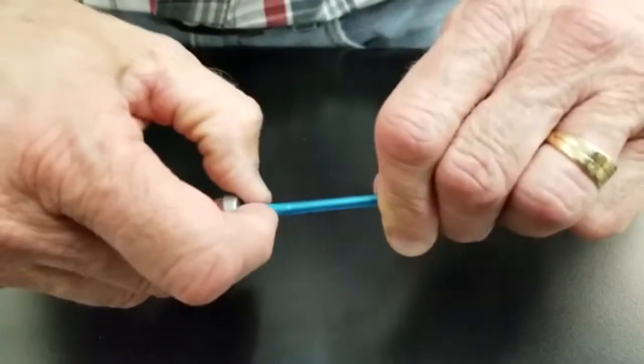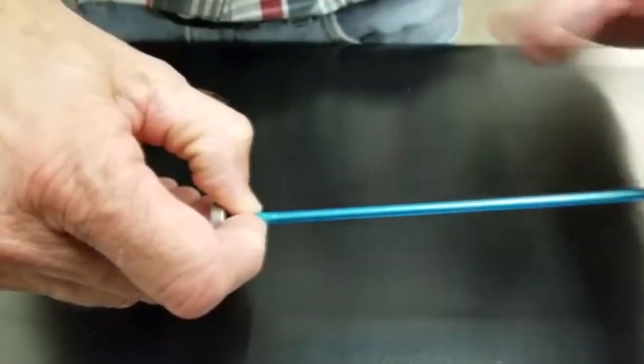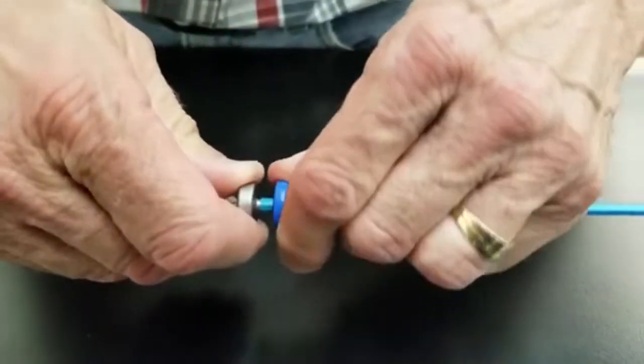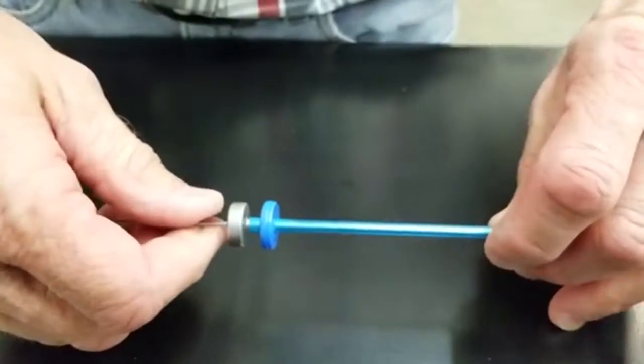Hold it with your fingers — there's some tension at this point. Bring the doughnut down, twist it in place, and you're ready to go transfer.